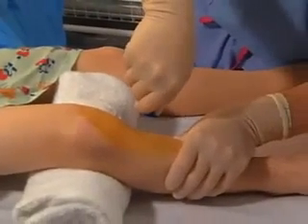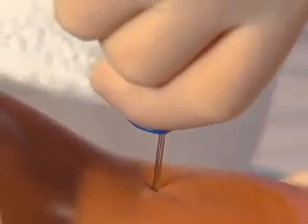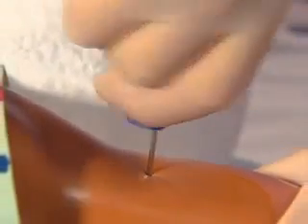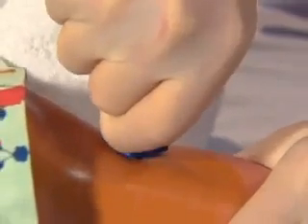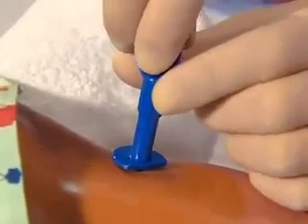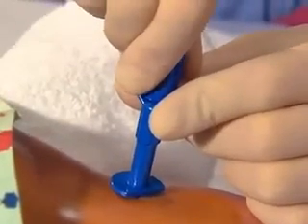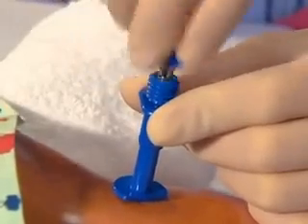Place the needle against the skin overlying the site. Puncture the skin and continue through the soft tissue. Use firm, steady pressure and a rotating or coring motion to penetrate the bony cortex. You will note a sudden give with the loss of resistance as you enter the medullary cavity. Remove the needle cap and stylet.